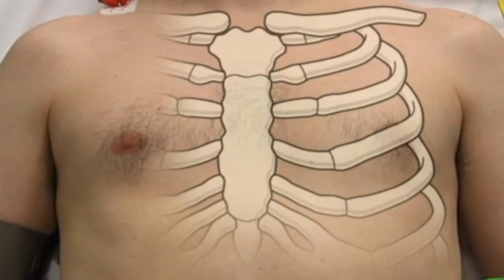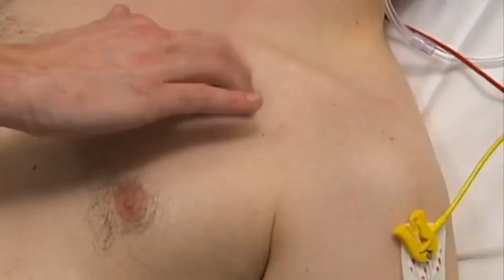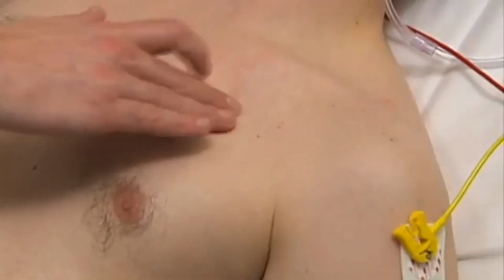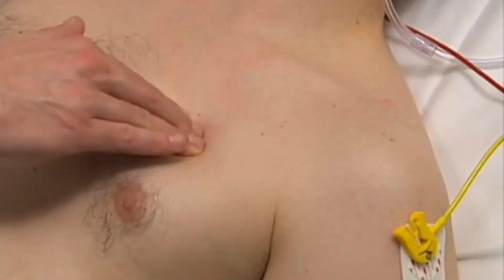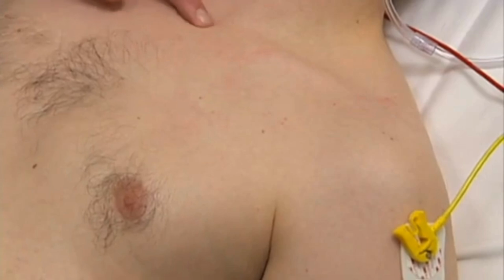The preferred location for placement of a needle for aspiration of pneumothorax is the second intercostal space, in the midclavicular line. On the side with the pneumothorax, begin by locating the second and third ribs. The second rib is the first palpable rib that can be felt just below the collarbone. Then locate the third rib. The second intercostal space is the area between the second and third ribs.